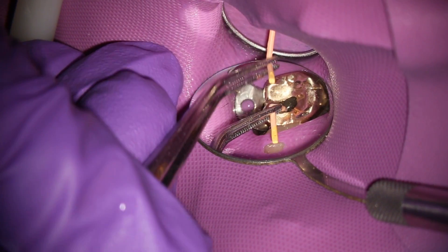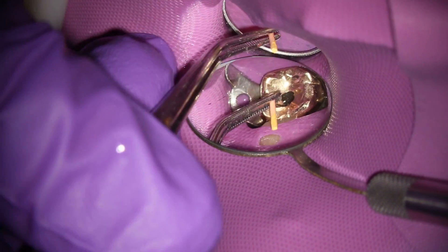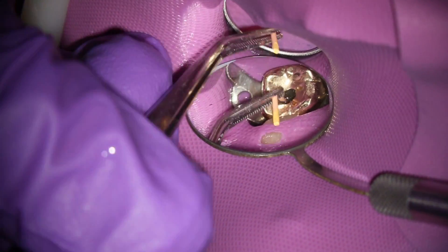This is an MB1 and an MB2 I'm retreating. And then I go in with alcohol. I'll flush with alcohol, getting the needle relatively close to the terminus. And you can see there's still some calcium hydroxide coming out.